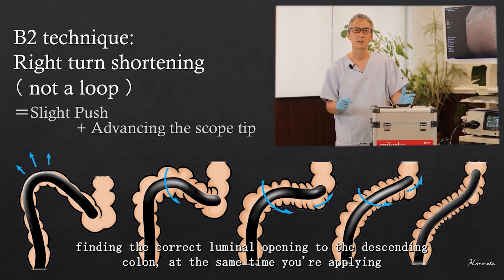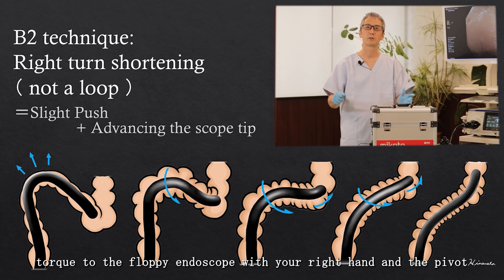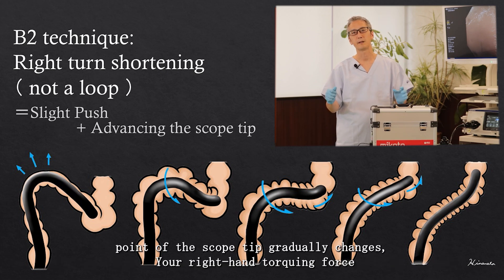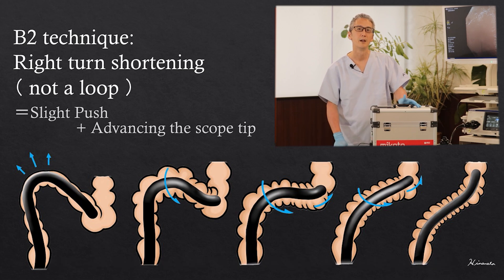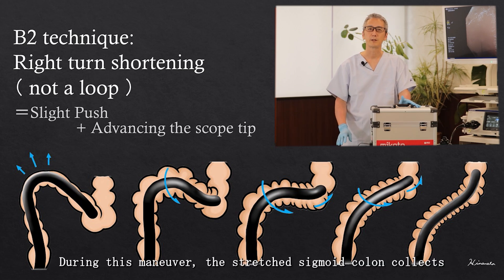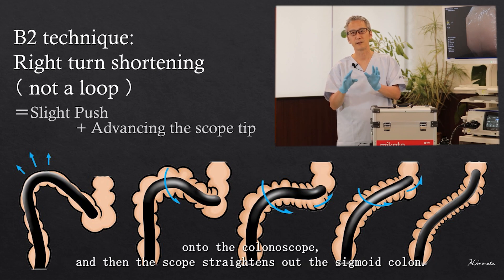At the same time you're applying torque to the floppy endoscope with your right hand, and the pivot point of the endoscope tip gradually changes. Your right hand torquing force makes the scope tip advance further into the descending colon. During this maneuver the stretched sigmoid colon collects onto the colonoscope, and then the scope straightens out the sigmoid colon.